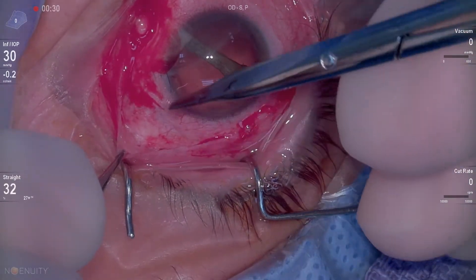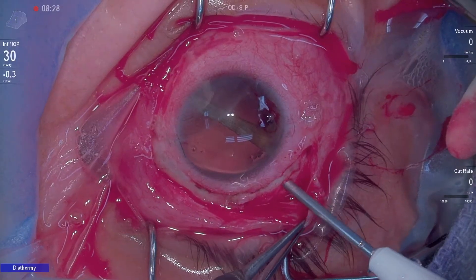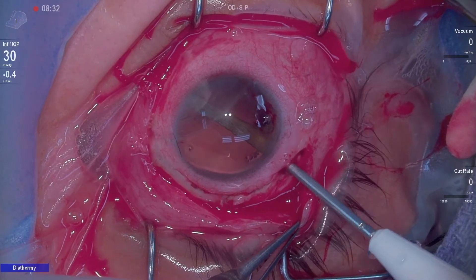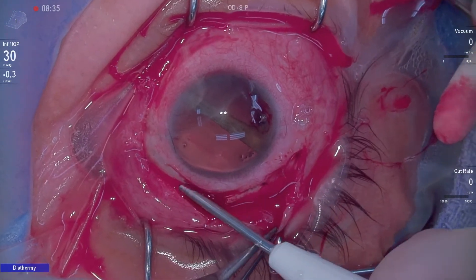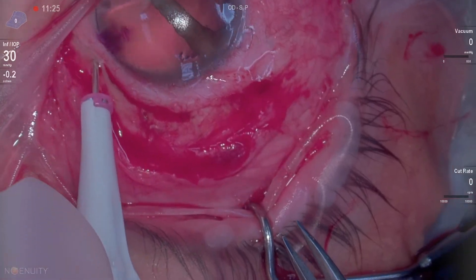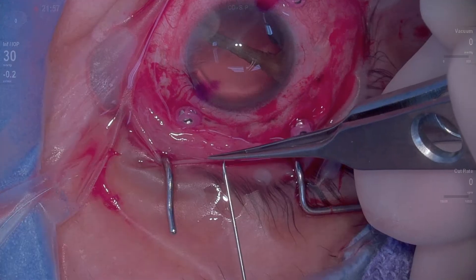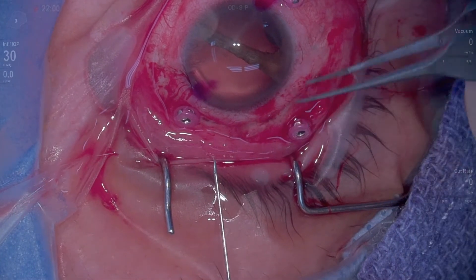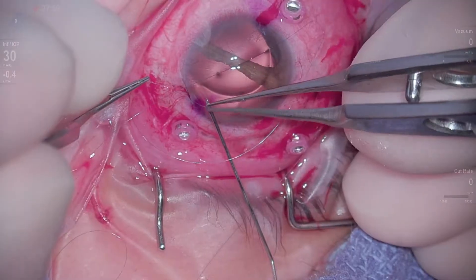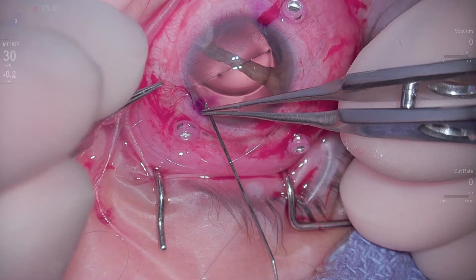This was nearly my favorite case of 2020. A really nice gentleman who had had a severe injury to his eye — open globe, repaired elsewhere — and he came in with this dislocated crystalline lens in the back of his eye and an iris dialysis for about 180 degrees. Our original plan was to suture the iris with this very novel sewing machine technique.